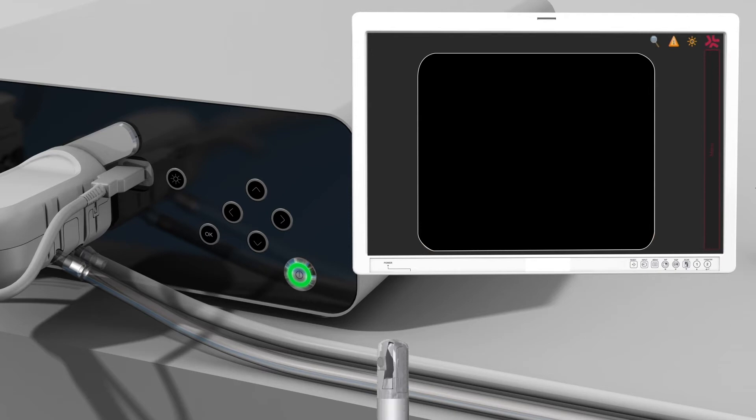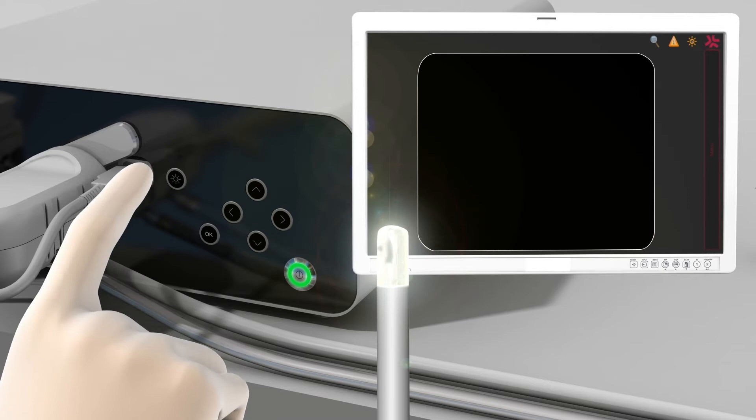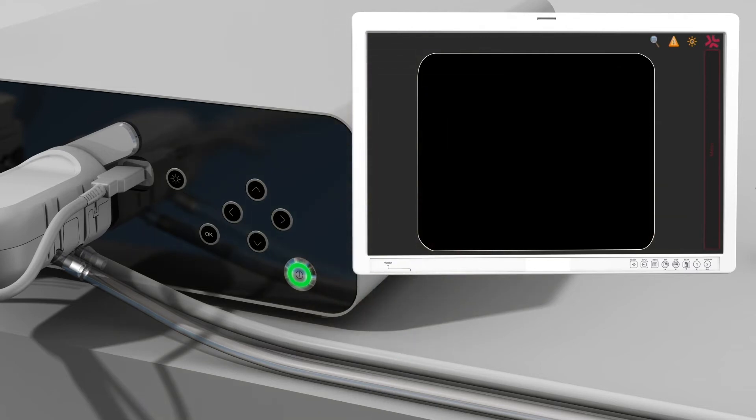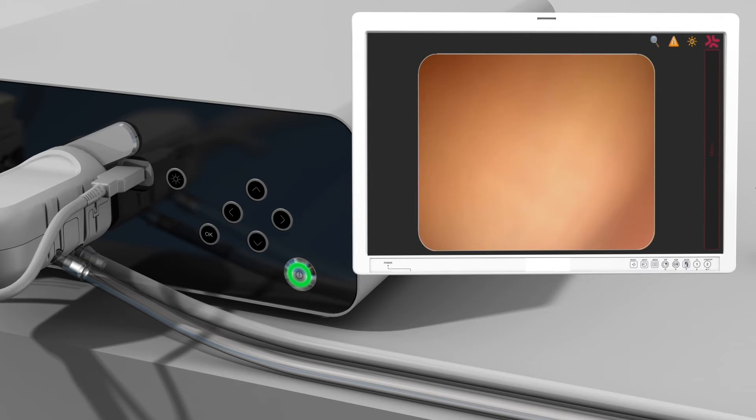The LED lights can be activated by pressing the light activation button located directly to the right of the USB connection on the front of the A-Box Duodino. Ensure that neither patient nor staff are in the path of the LED lights. It is strongly recommended to turn the LEDs on just prior to inserting the scope into the patient. The external monitor now displays a live image from the camera and symbols of active functions along the top right edge of the display. Roller pump status and alerts for any messages are provided in the Info tab, as well as the brightness level assigned to the LED lights.